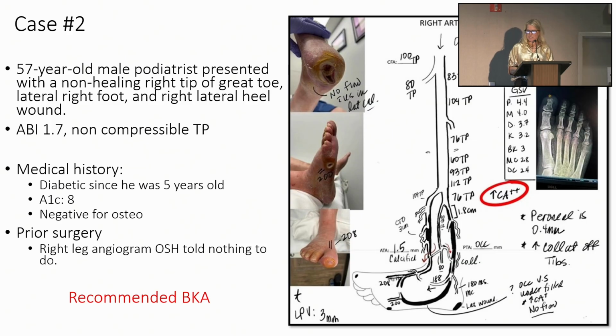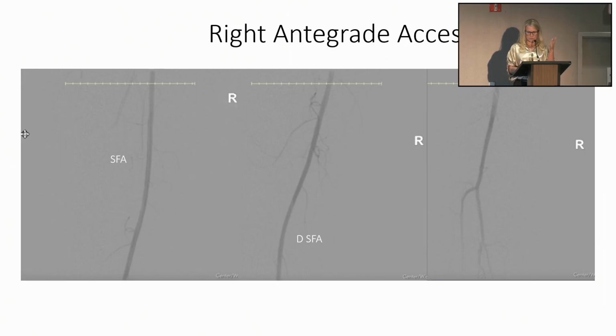Yes, I've mapped the GSV, but I don't think he's a good bypass candidate. In my mind, this is an endovascular case, and I really mapped him for DVA, deep venous arterialization, where we connect the artery to the vein. So at this first duplex, the surgeon has the choice to do endo or straightforward revascularization or DVA. So she elected to do just straightforward revascularization.